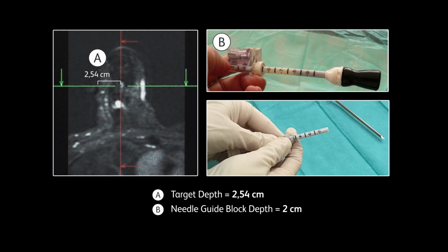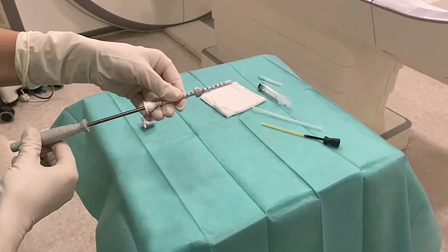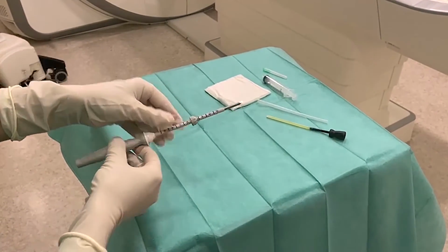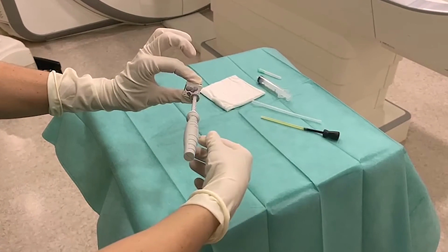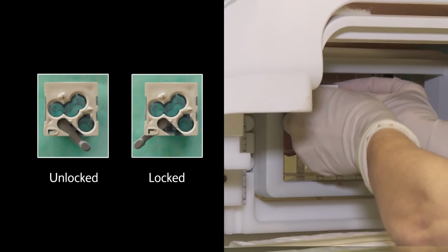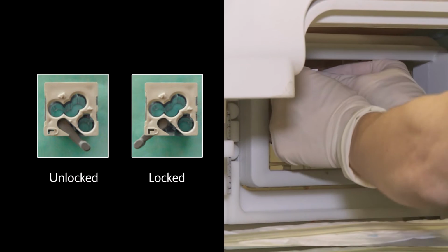The cannula stop is placed at 4.54 centimeters in the cannula marking. The trocar is fully introduced into the cannula. Verify the final setup before the needle guide block is inserted in square 11D1. The needle guide block is inserted, unlocked position, in square 11D1 orientation. Move the lever to the locked position.